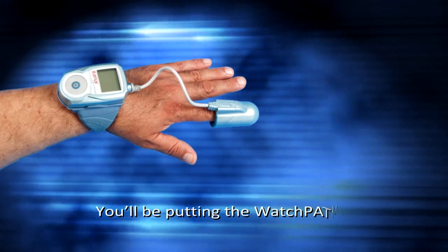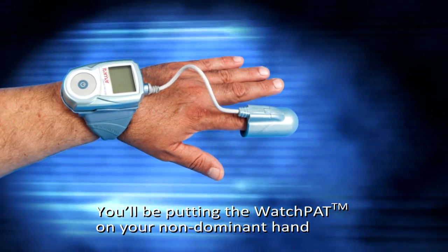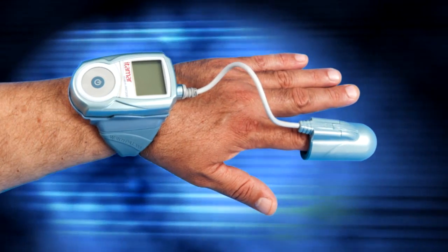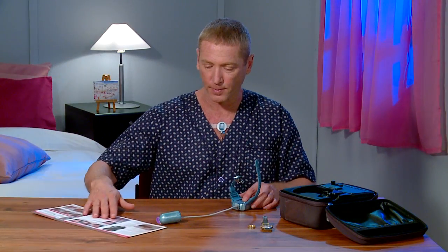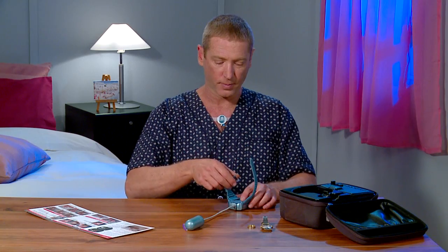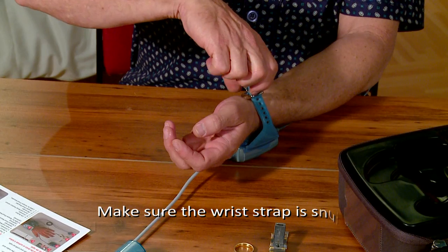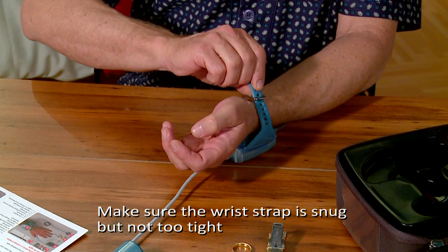You will be putting the WatchPat on your non-dominant hand. Here you see how a right-handed person puts the device on his left hand. Place the WatchPat on a flat surface, then insert your hand and close the wrist strap, making sure it's snug but not too tight.